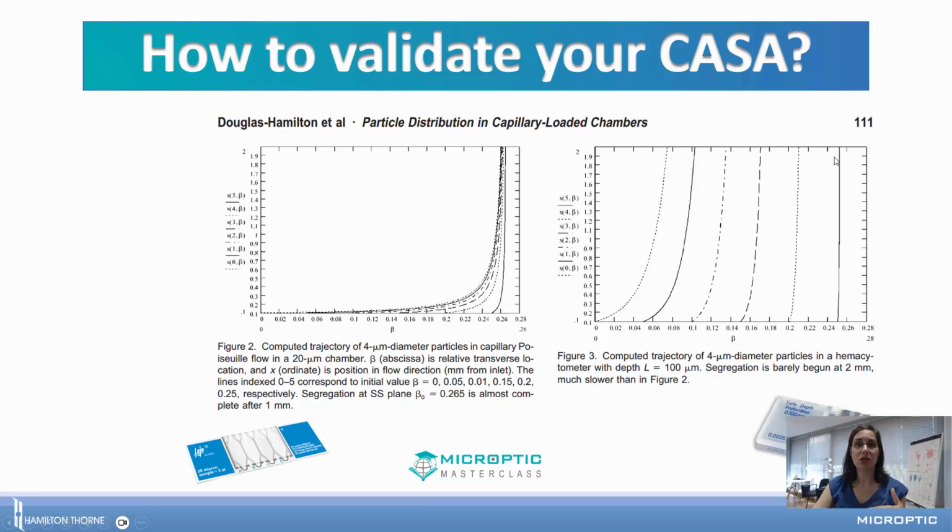So the distribution of cells is practically homogeneous over the area of the counting chamber. This is why it is used as a gold standard for assessing sperm concentration. Because it's very accurate and also the distribution of cells over the chamber is fully homogeneous.